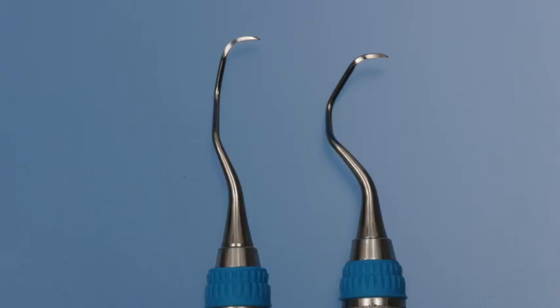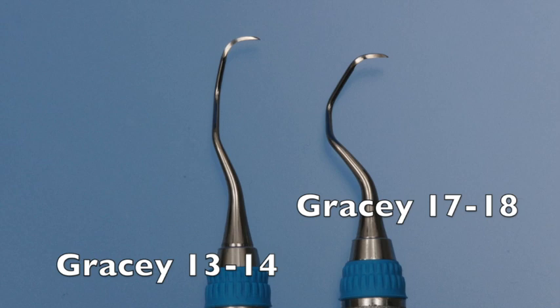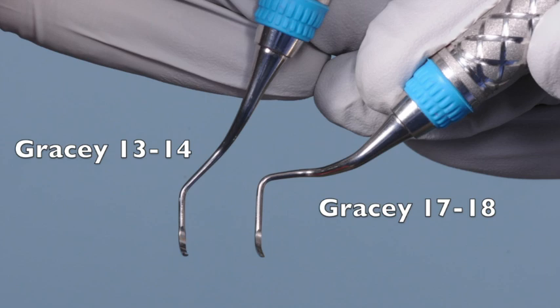The design characteristics of the Gracey 1718 improve adaptation to and instrumentation of the distal surfaces of posterior teeth. When compared to the Gracey 1314, the Gracey 1718 has accentuated angles, a longer terminal shank, and a blade that is 1 mm shorter. These characteristics enhance handle positioning and reach the most posterior distal surfaces of the teeth, access pockets, and allow the whole blade to be adapted to the tooth surface.